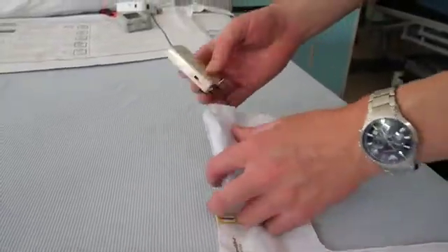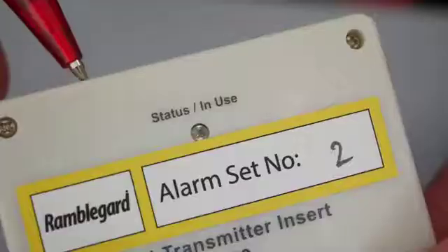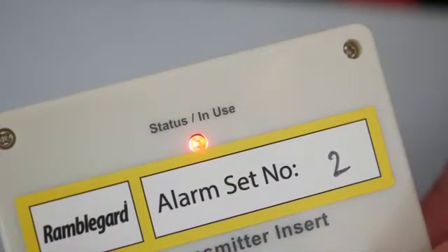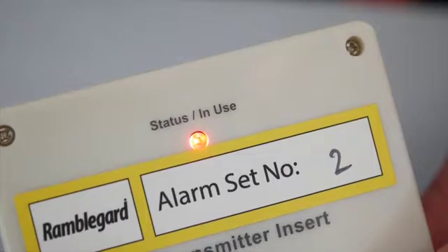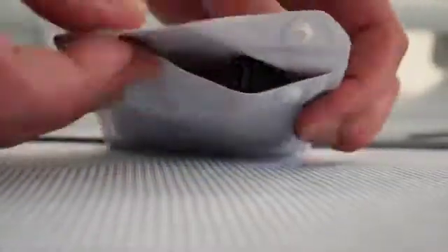Next, open up the pocket of the pads, take out the transmitters, and switch from the off to on position on the transmitter. The red status light will show and then flash three times before going back to standby. This confirms that the transmitter has been switched on and is operating correctly.